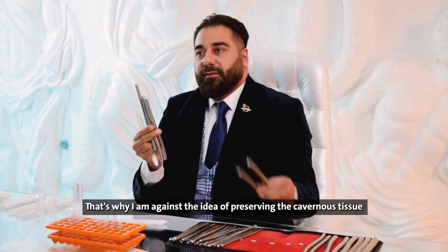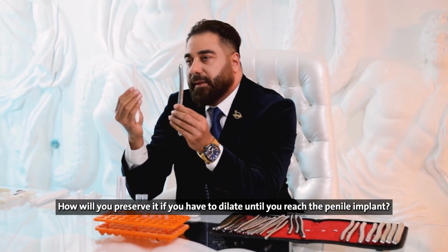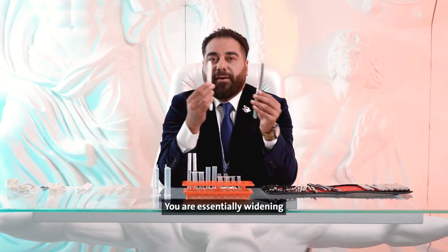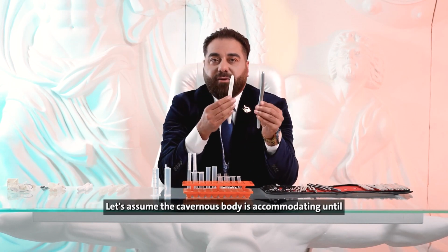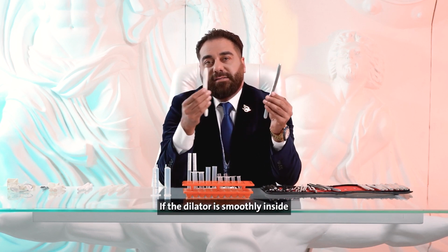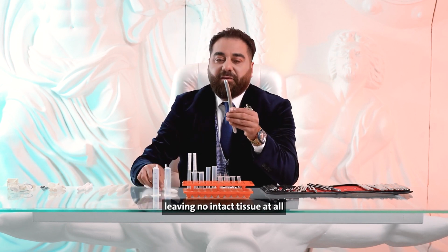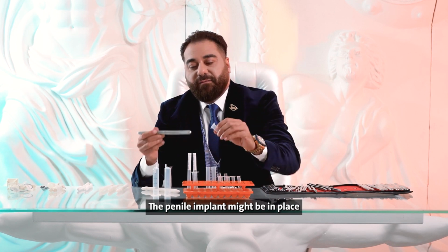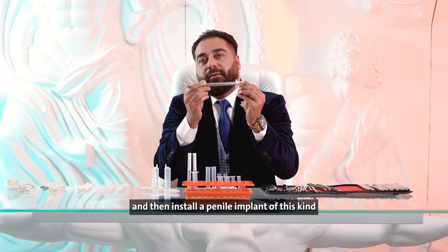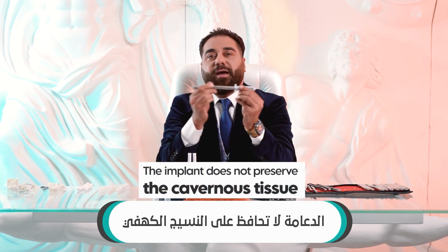That's why I am against the idea of preserving the cavernous tissue with the flexible penile implant. How will you preserve it if you have to dilate until you reach the penile implant? You are essentially widening. Let's assume the cavernous body is accommodating until it meets the penile implant, and the dilator is smoothly inside. If the dilator is smoothly inside, it means I have completely destroyed the tissue, leaving no intact tissue at all. The penile implant might be in place, but I cannot widen the body to this extent and then install a penile implant of this kind, as it won't fit because the expansion is not sufficient.